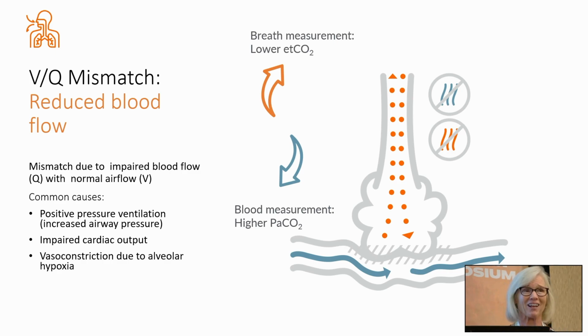So she gets the blood gas, and we all hold our breath a little bit, and it comes back 80, spot on with the transcutaneous value. His ventilation perfusion mismatch was so great, it was 30 points off, because he had pneumonia, because he had chronic lung disease from being intubated his whole entire life. And I tell you, the girl who did the blood gas, she pulled me aside later and said, man, I thought for sure your monitor was way off, but you guys were spot on.